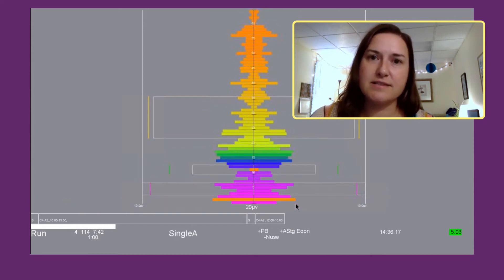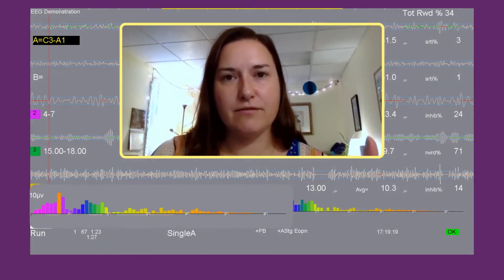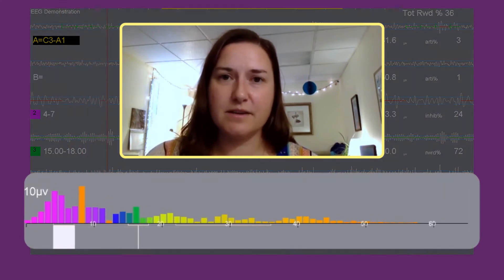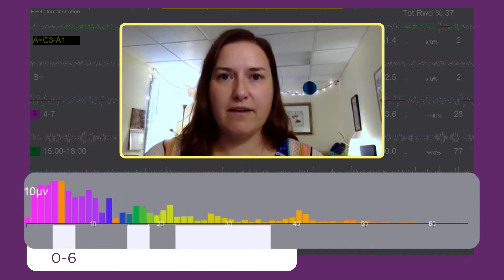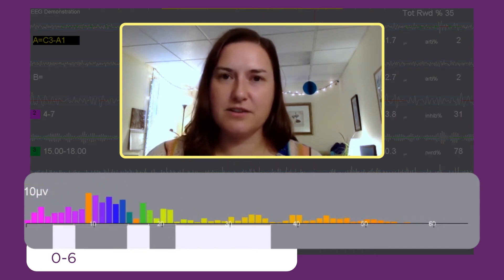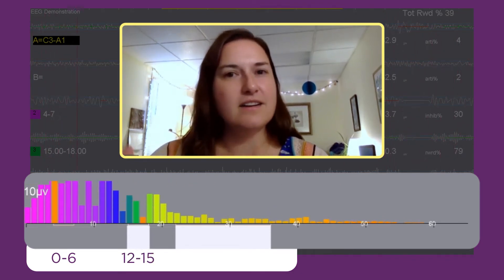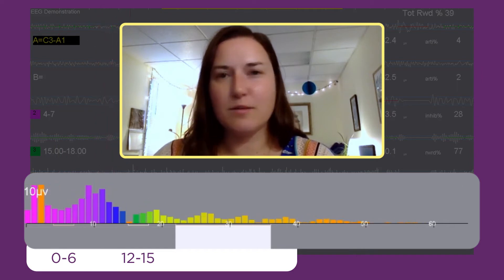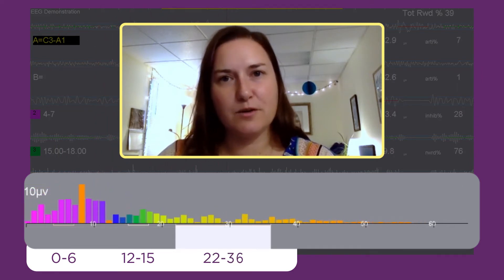Under the pulsating colors are these little brackets. So if you have a three-trace protocol set up, you will have three little brackets. One is going to be underneath your inhibit — so if you set it zero to six, you will have a little bracket under there denoting that that's where your inhibit is. If you set your reward at 12 to 15, you'll have a little bracket under there, and your high-frequency inhibit 22 to 36 will also have a little bracket underneath.